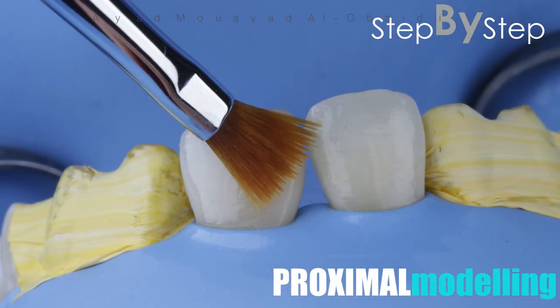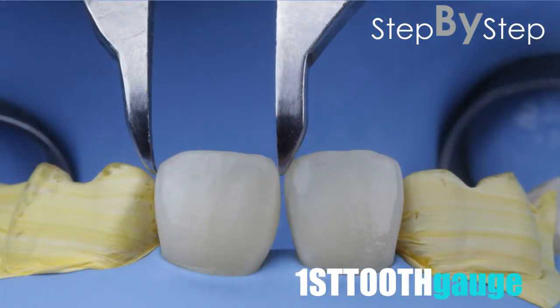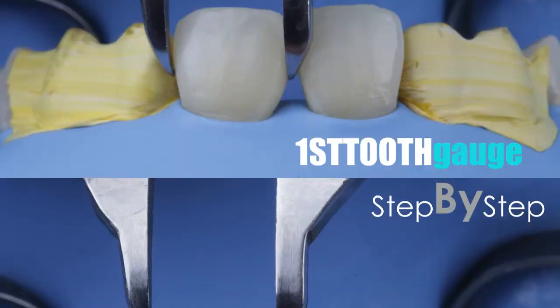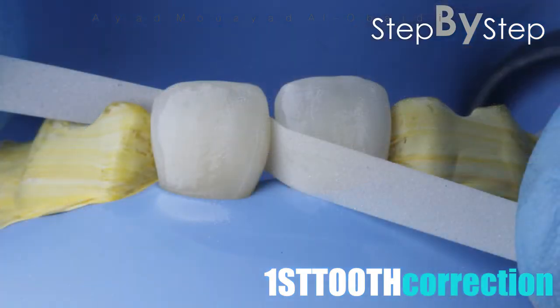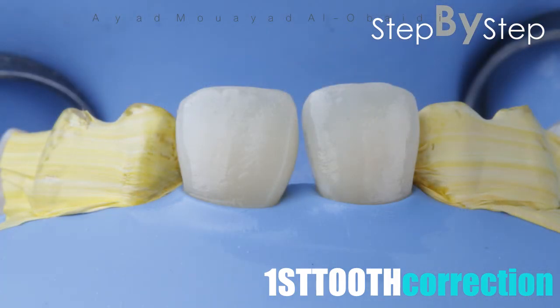Complete the rest of the proximal wall using body shade composite. An important tip I prefer is to complete the first tooth entirely before starting the next tooth. We gauge the size of the tooth from cervical, middle, and incisal thirds, and correct the size if needed using a metal strip, then polish using a polishing strip. Now the first tooth is finished and polished.